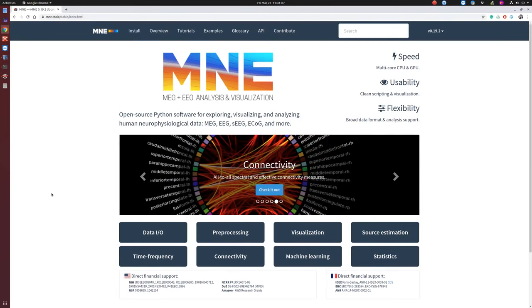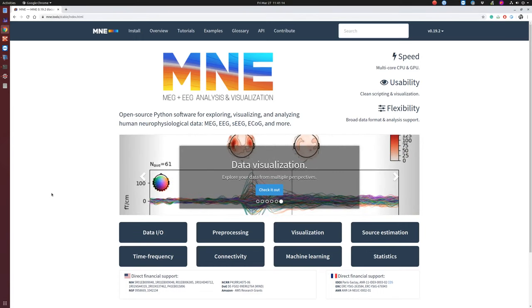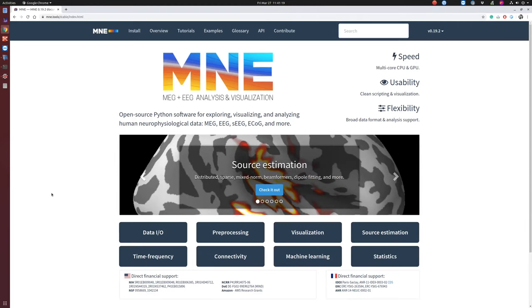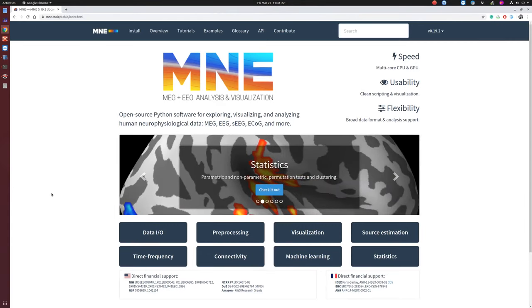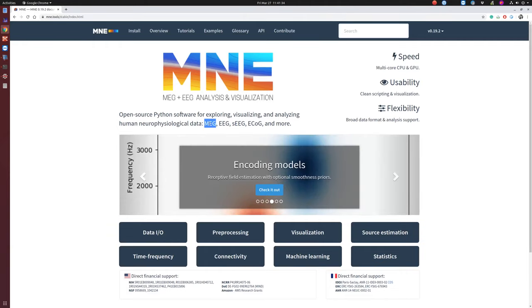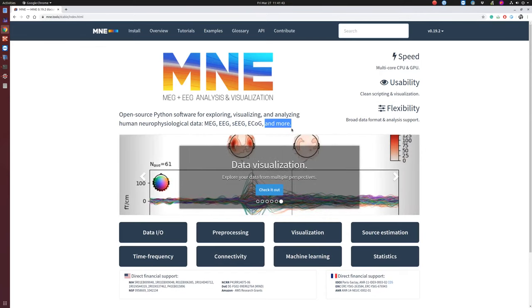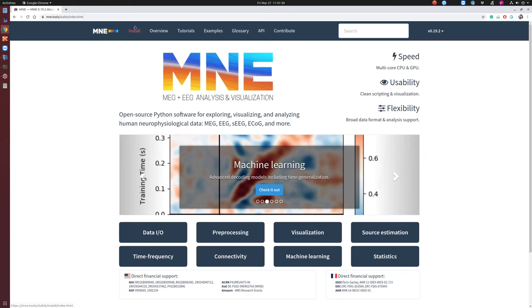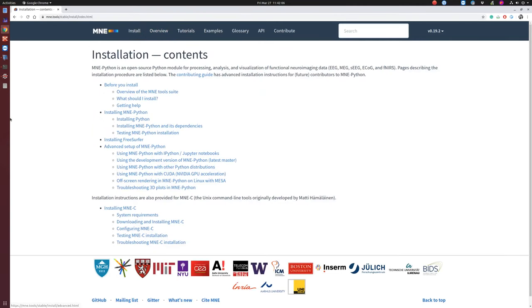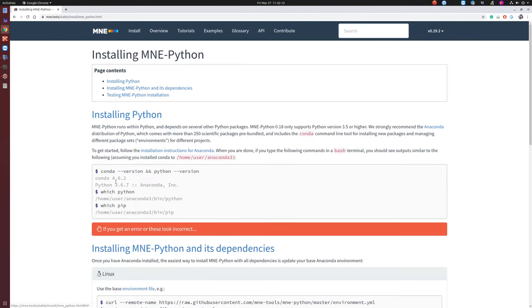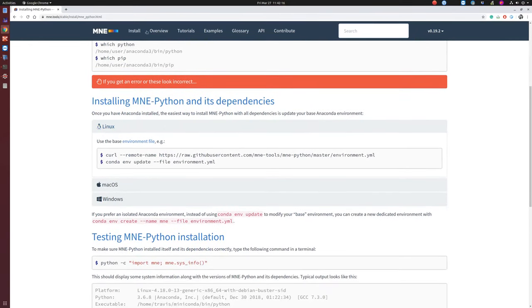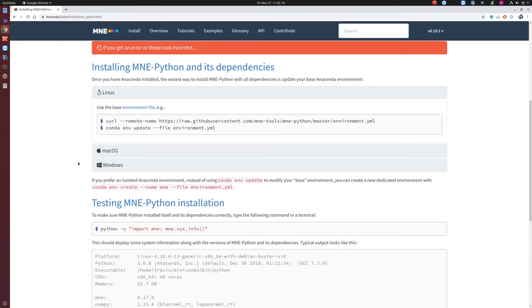In this video, I will introduce you to a software called MNE. It is a Python-based open-source software developed for analyzing human neurophysiological data. Mainly, you can use this toolbox for analyzing MEG, EEG, SEEG, ECOG, and many more time series kinds of data. The website provides a lot of tutorials.